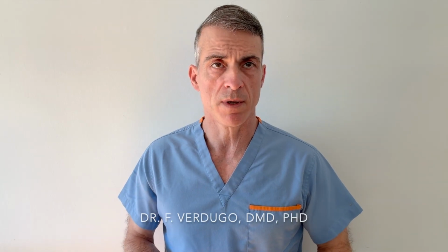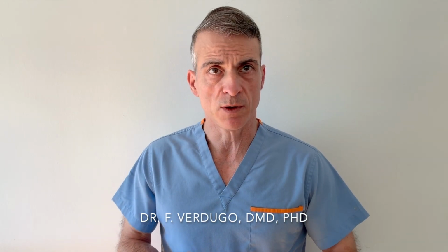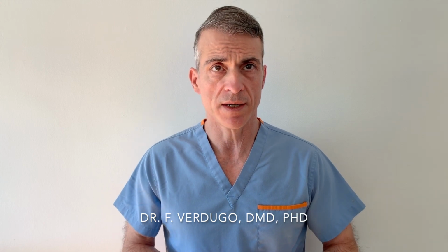My intention with this video is to bring awareness of the steps that need to be taken to achieve an ideal aesthetic clinical outcome in implant dentistry, especially when we place implants in the front, in the anterior area. This will help both patients and dentists understand what we can do to achieve ideal aesthetics and good long-term clinical outcomes. Implant provisionals must be delivered to guide the soft tissues to heal properly and aesthetically around that implant restoration. Implant provisional restorations help sculpt the tissue until we can achieve an optimal symmetrical aesthetic outcome.